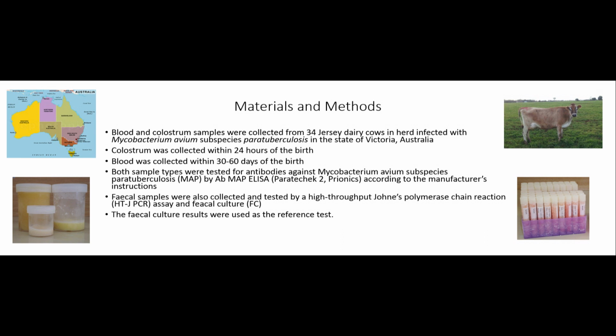Now, you may well ask, why did you separate the bleeding from the collection of the colostrum? Partly it was physical, and partly it's to be very conservative. If you look at serum levels around parturition, you get a big dip in serological antibodies, and the recovery phase is 30 to 60 days out from that. So in other words, we're giving serum every chance to perform as well as it can.